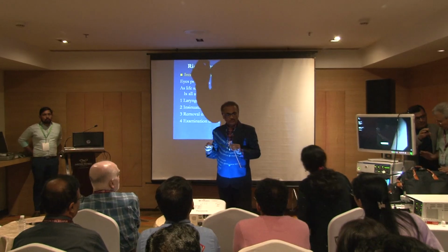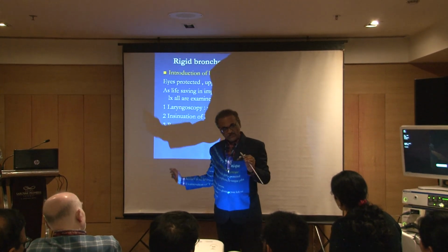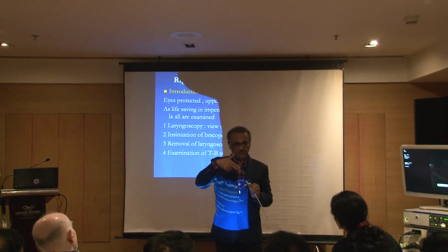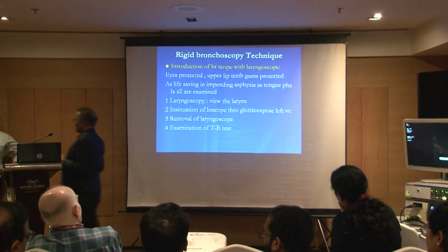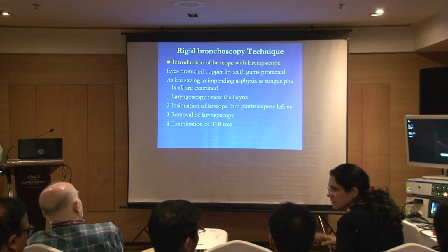that time you are not going to do suction. You have to do suction. Take out the suction cannula, separate, and then have the telescopic forceps. With the telescopic forceps there is no suction. With the naked scope, we can do the suction.